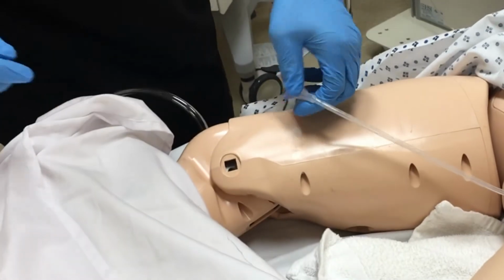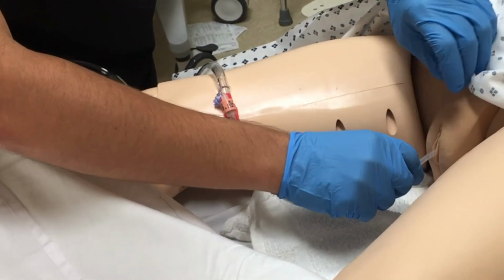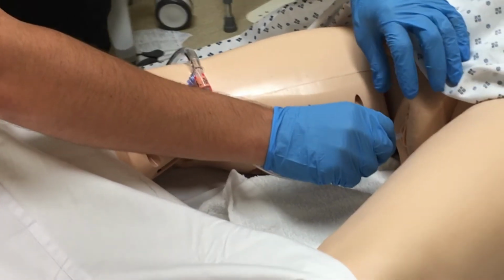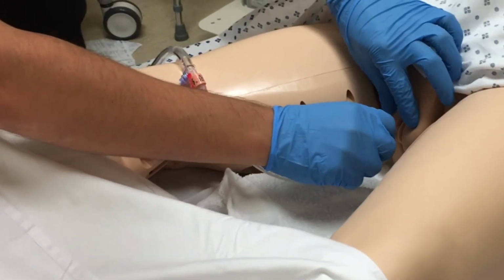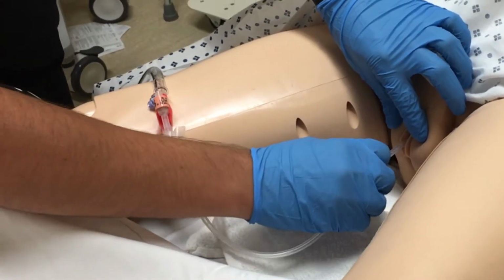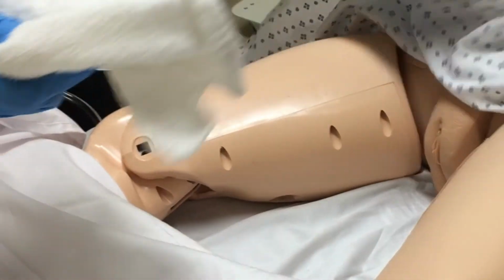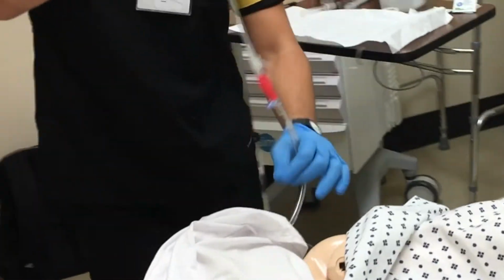Remove the adhesive. And I want you to take deep breaths for me. On the count of 3, we're going to pull it out. All right. 1, 2, 3. All right, I'm going to wrap this in a towel and dispose of this properly.